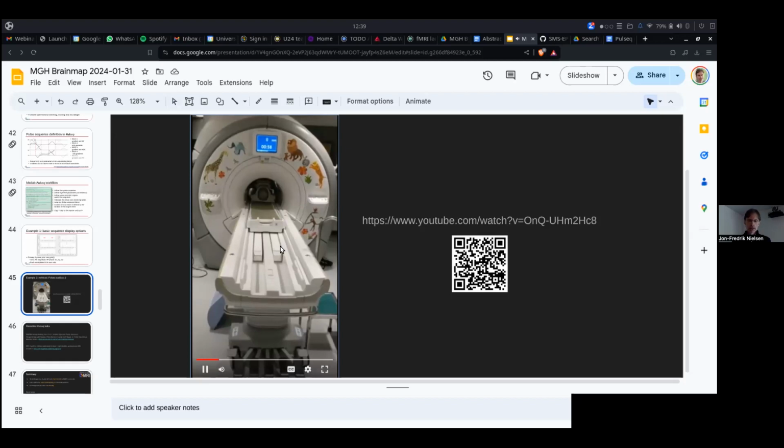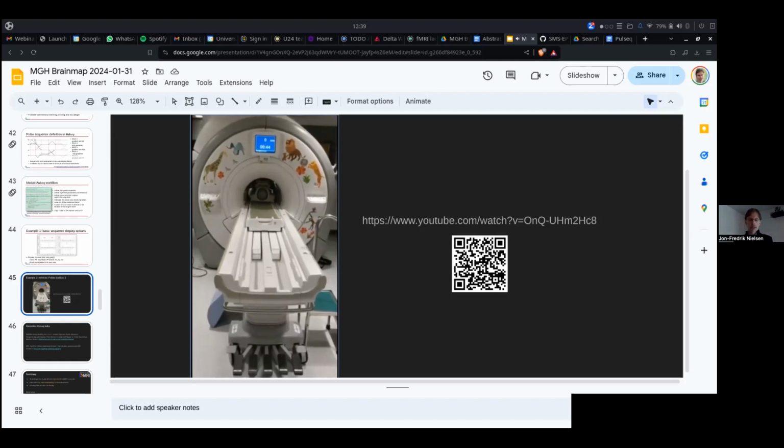This is playing arbitrary waveforms on 3 gradients. You have three notes to play with, and then Maxime put this together and played it on his Siemens scanner, and then I couldn't resist and did it on our GE scanner as well.